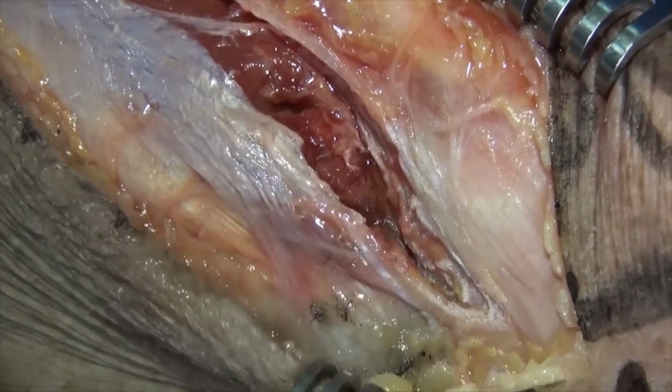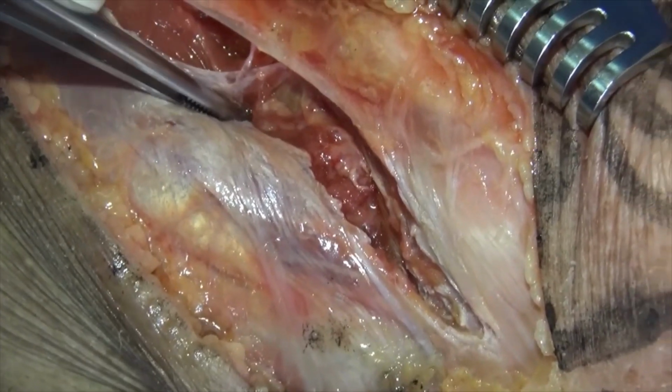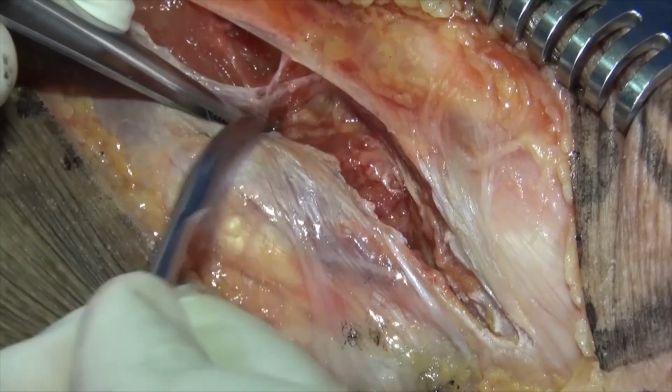Right, use my periosteal elevator further. Where is the big one? Oh, never mind, we'll just use this.